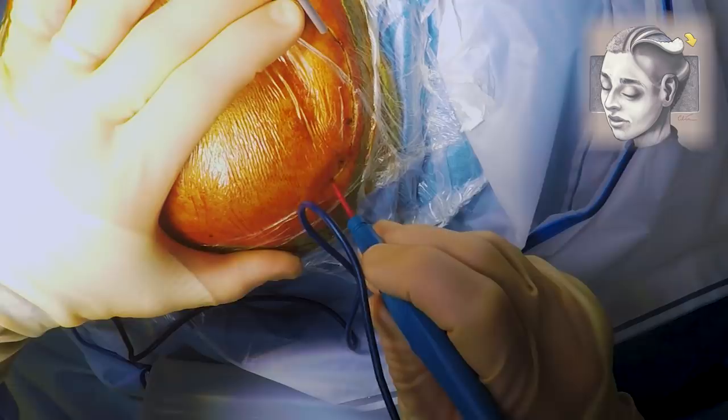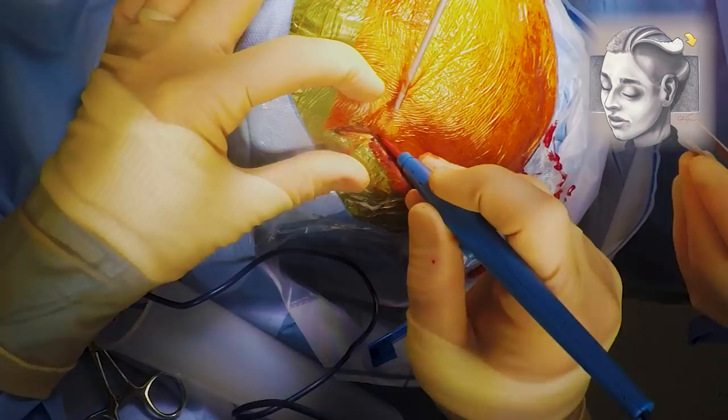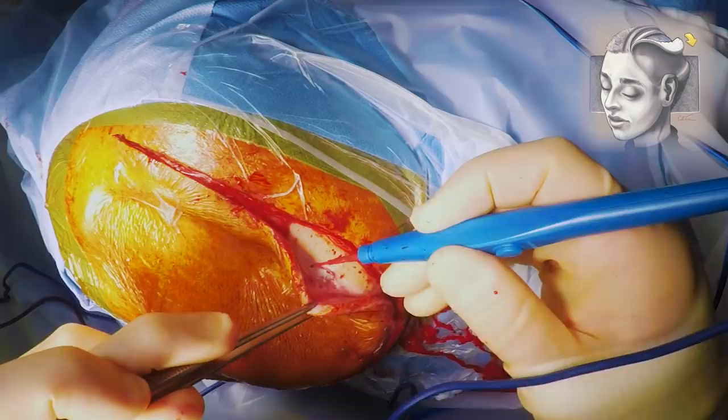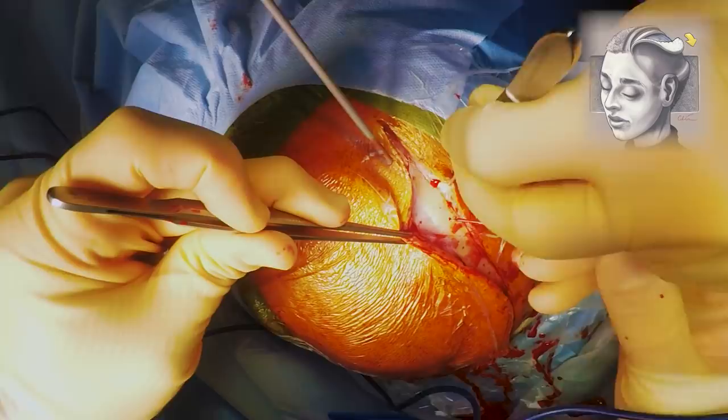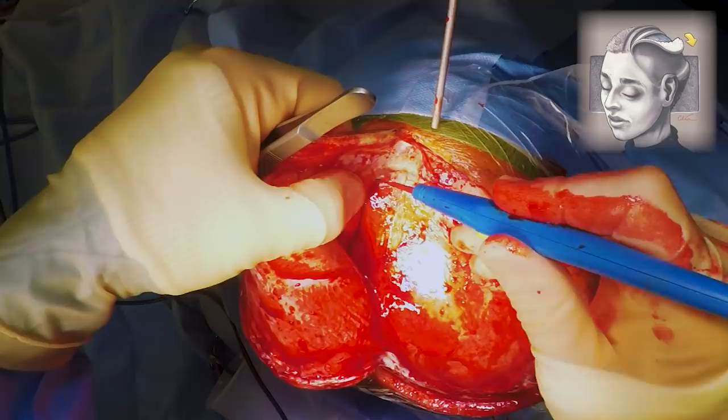He's using a cutting tool called a Colorado and this is burning through the layers and sealing them as it goes along. The scalp has a very good blood supply and it can bleed quite profusely, so it's important to get control of this bleeding as soon as possible. You can start to see the layers covering the brain coming into view as well as the skull. We have to be very careful here so that we don't damage the brain that might be underlying this. After several months quite a lot of scar tissue will have been formed and sometimes it can be really stuck down towards the brain and its coverings.